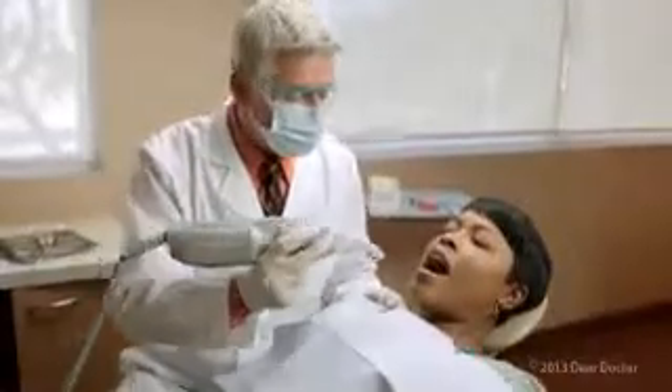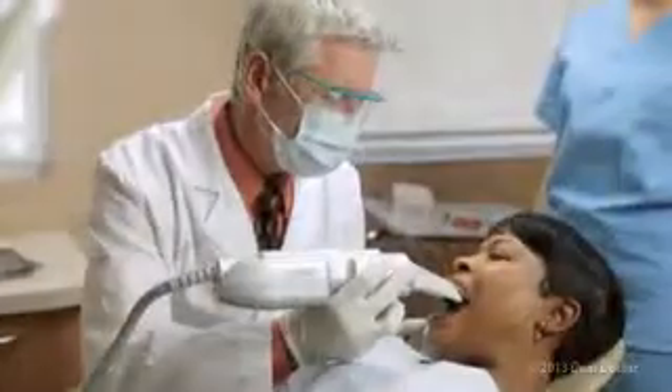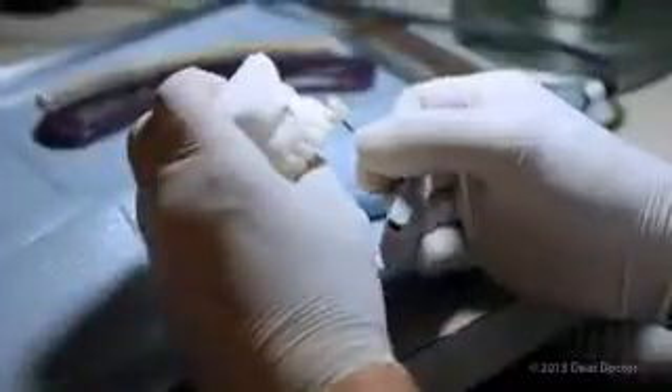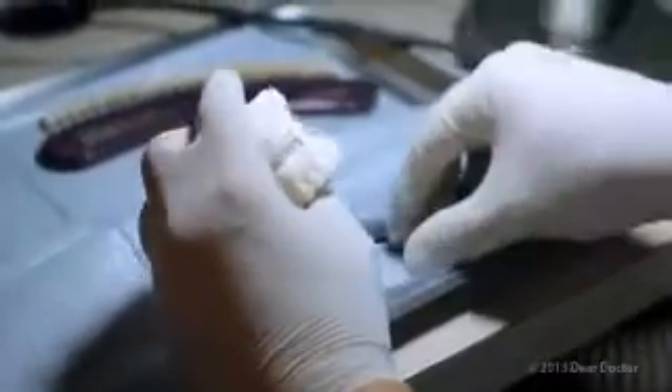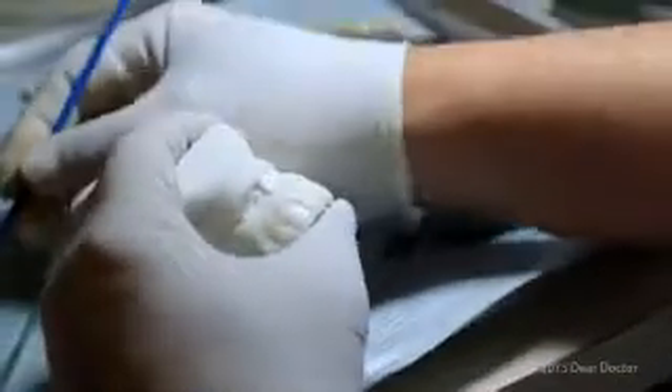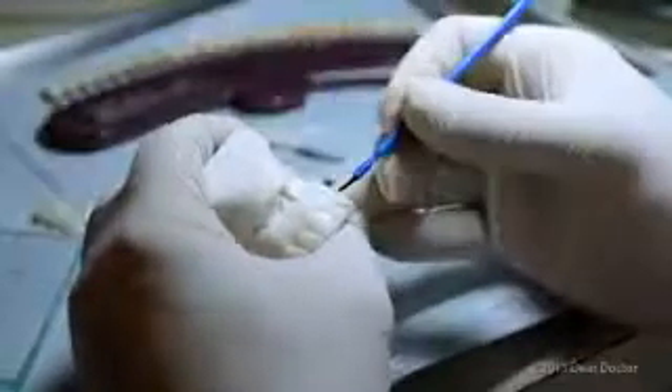After the tooth is prepared, your dentist will take an impression. What happens next will depend on whether your dentist makes the crown right in the office or, more commonly, has it made in a dental laboratory. There, highly skilled technicians will create a crown made of porcelain, metal, or a combination of the two that looks great and functions perfectly within your bite.